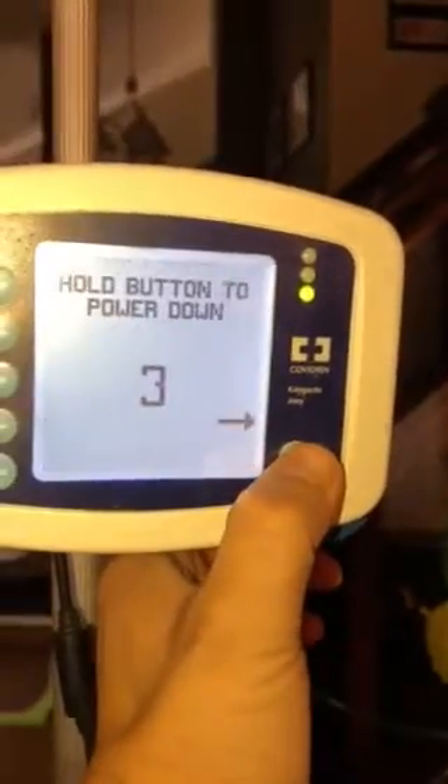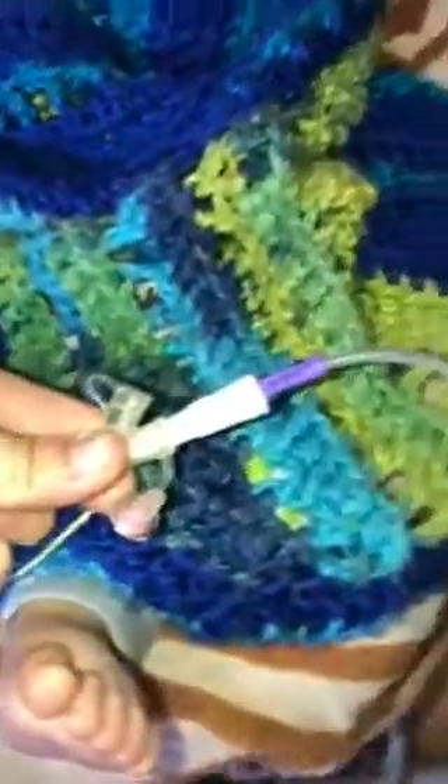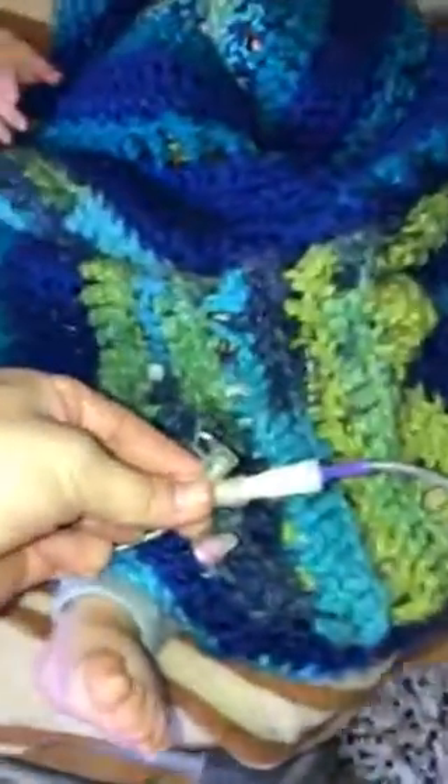Hold down on the power button for 3.5 seconds. When you come back over here, just like before, you're going to pinch the yellow tube and put it in — otherwise all the food will come right back up at you. Pull the plug, plug it back in, and I'll show you flushing here in just a second.